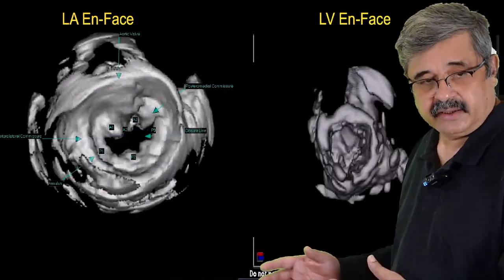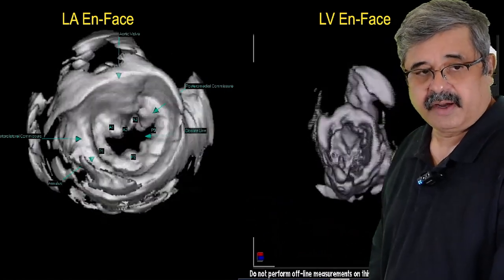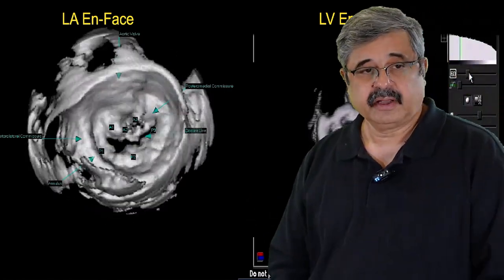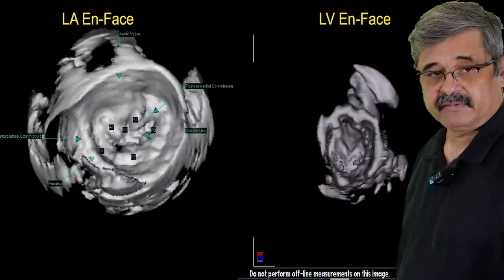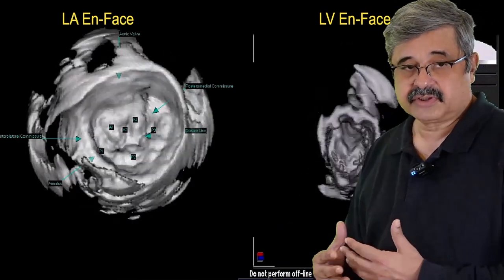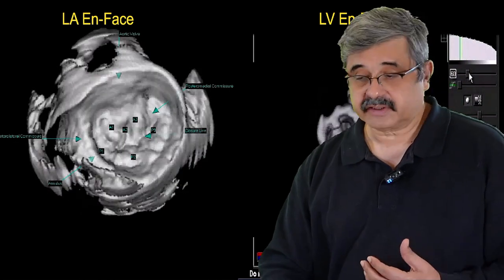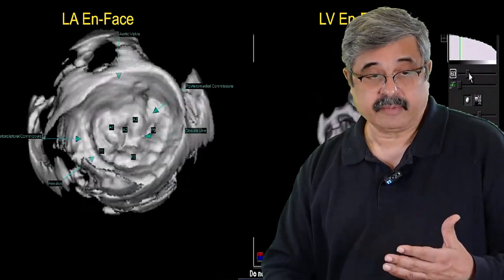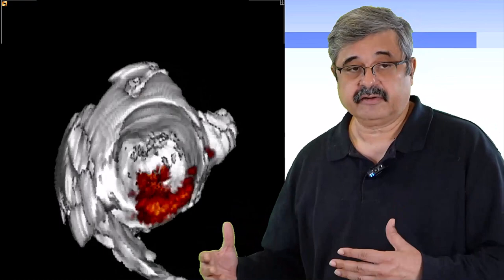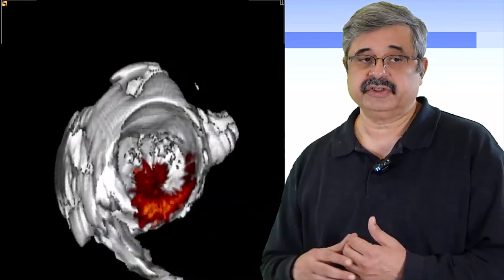Besides an en-face view of the aortic or mitral valve, you could also look at an LV aspect of the mitral valve. Again, this was not a live image — it was a reconstructed image acquired after a lot of time, about two to three minutes. You could also incorporate grayscale information as well as color Doppler information. In this patient, you can see a retracted posterior leaflet with a posteriorly directed mitral regurgitation jet. The image quality was decent, but there were many steps to complete before displaying it for clinical interpretation.